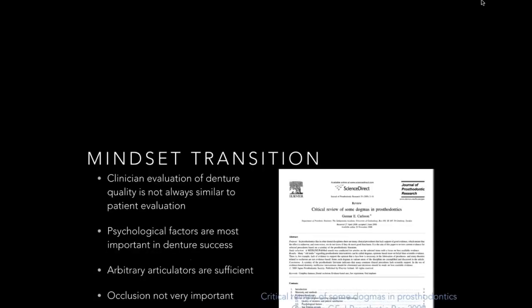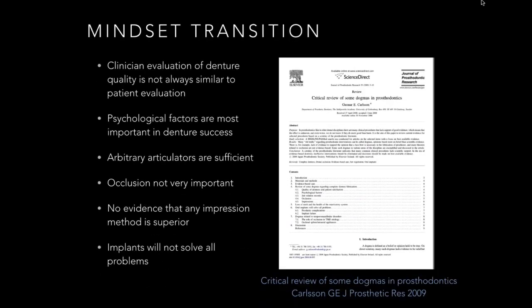And I said, okay, well, surely that's not good. Surely that's some sort of a gimmick. He said that they had been using it to retread hybrids, and that when you do that, the teeth in the acrylic are monolithic, and there are a lot of great advantages to it. So I decided to look into it. But there was one part that was missing.